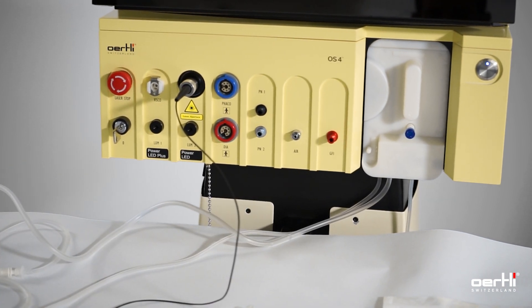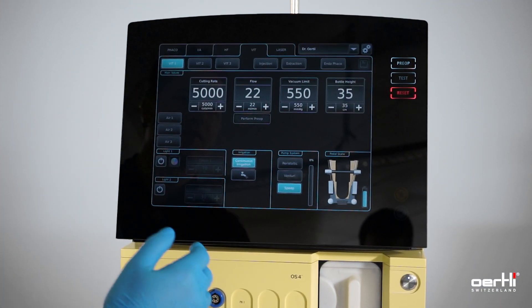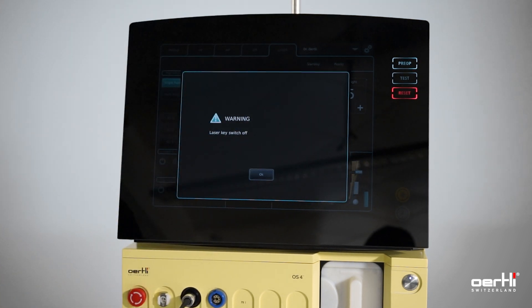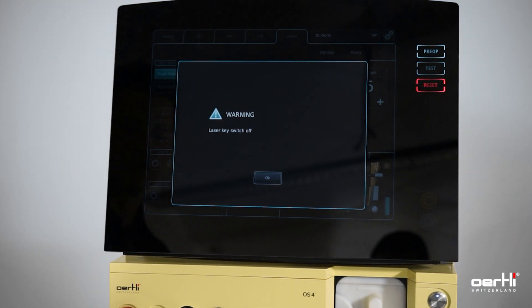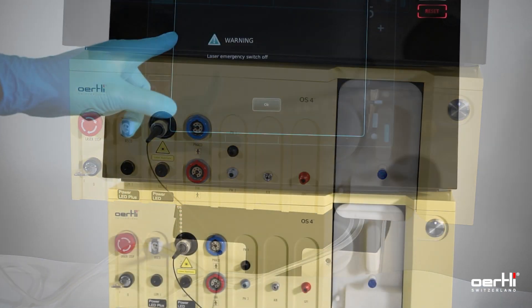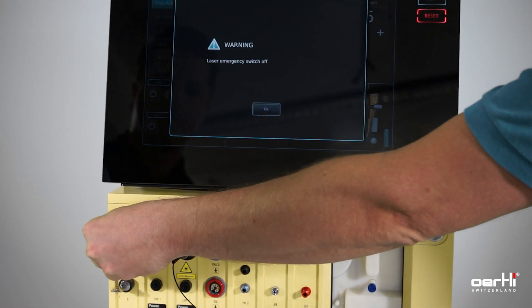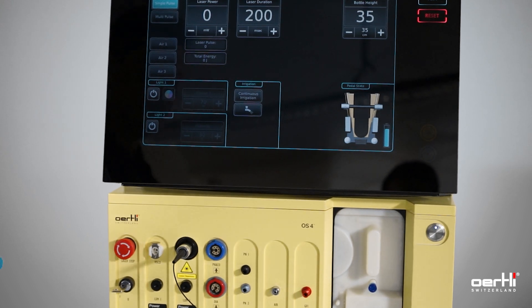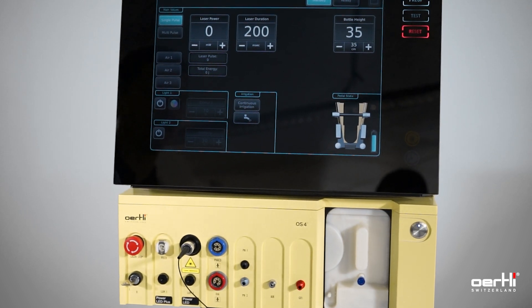Use the screen to prepare the laser function. Remember, usually we would have our sterile bag on the screen. Go into laser function and ask your jumper to set the laser key into position 1, then to release the emergency key.